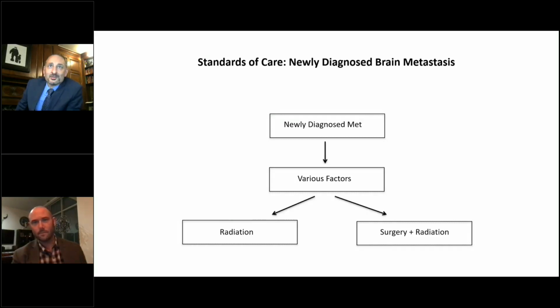I just want to echo what Peter said. We did a very similar case with a small pontine lesion just a week or so ago, and very much the same approach, sort of a retrosigmoid approach trajectory through the cerebellum.